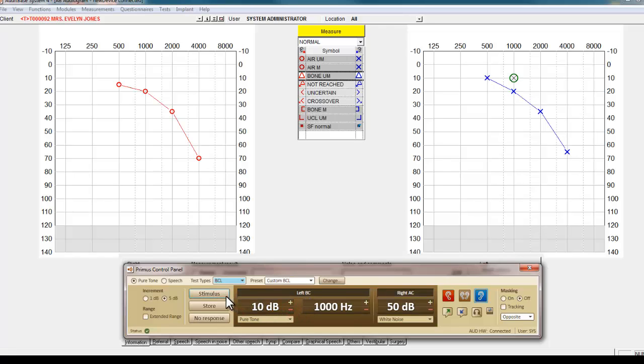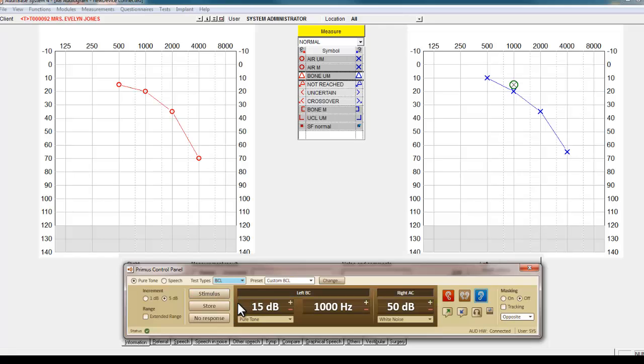Once bone conduction tests are complete, you can use masking as appropriate. You can then save the audiogram, which will be available for future use within AuditBase.